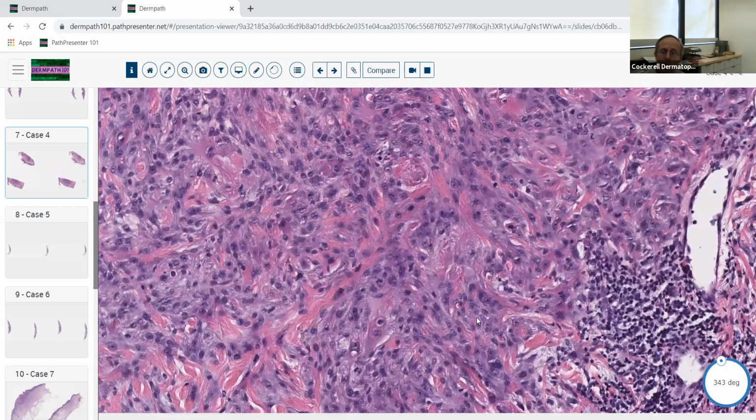Now, if you look at this and you see obviously that there's a nerve involved, then it's probably a cancer that got into a nerve and is now kind of reappearing, popping up, if you will, almost like a volcano that's erupted at a different site. It's kind of recurred because of the neurotropic spread. But a lot of times it's just like this. We just see an obvious squamous cell carcinoma sitting in the middle of the dermis, and we will ask the clinician, has the patient had a squamous cell carcinoma near this area before? A lot of times the answer is yes. Sometimes the answer is no.